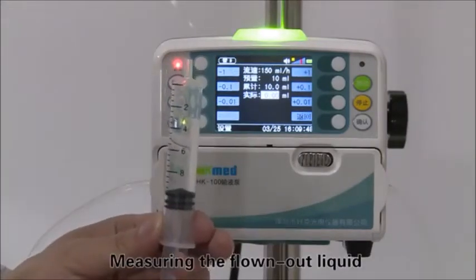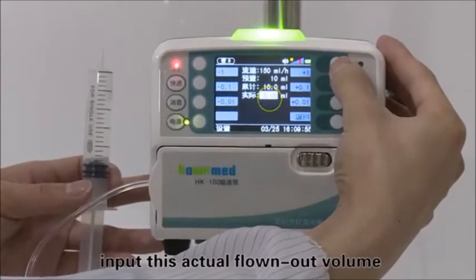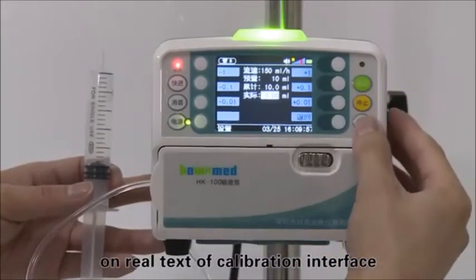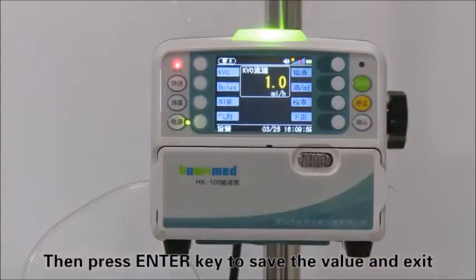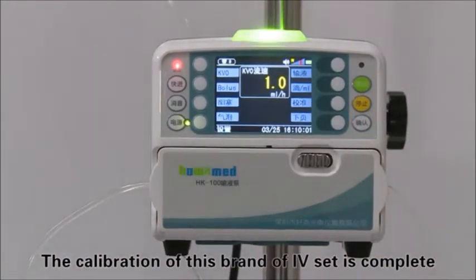Measure the liquid that has flowed out into the syringe or measuring cup. Input this actual flowed-out volume into the calibration interface, then press the enter key to save the value and exit.